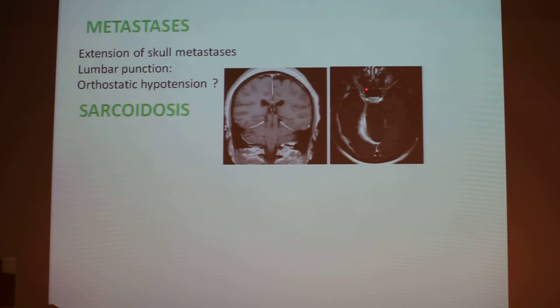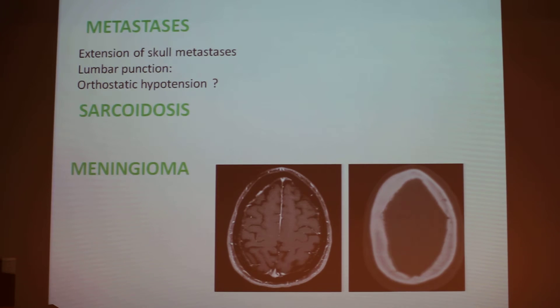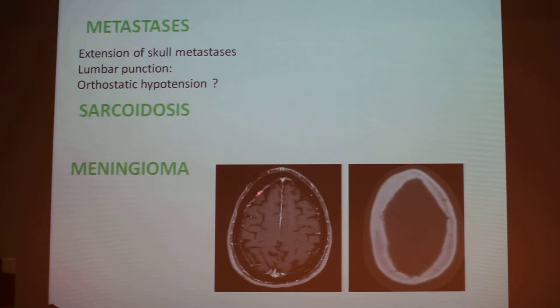Sarcoidosis can provide very thick thickening and enhancement of the dura. Also meningioma, which can be very tricky because the meningioma can be only bone — you see bone thickening with soft spikes and a little thickening of the meninges that cannot be seen on CT scan and has to be searched for on MRI.